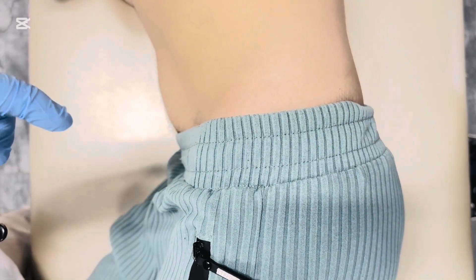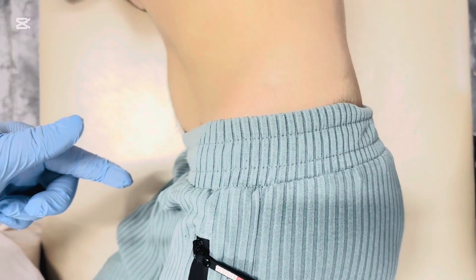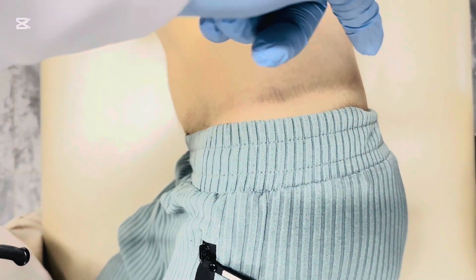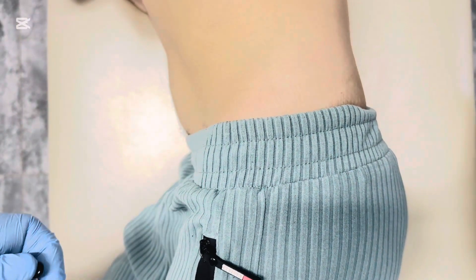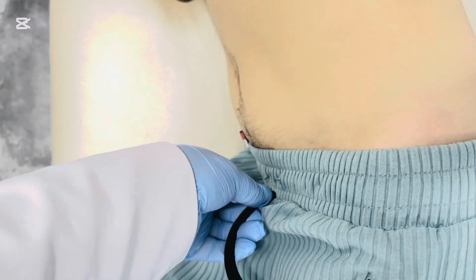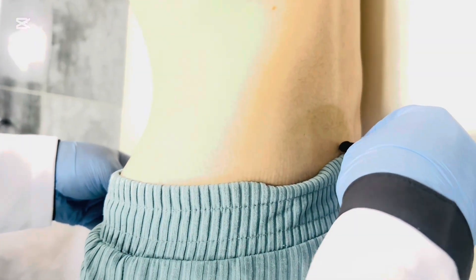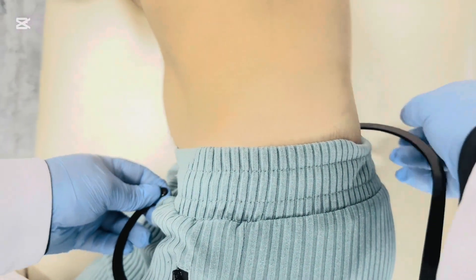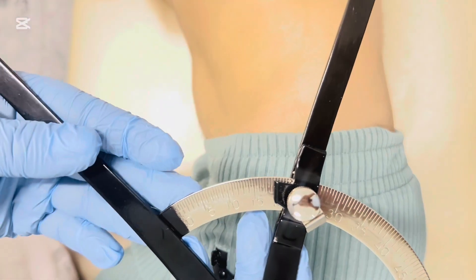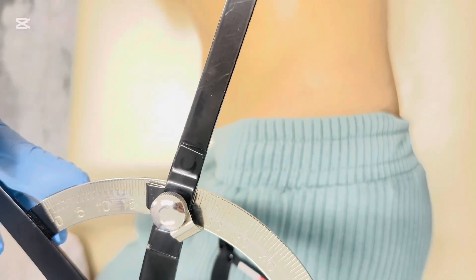We also have the conjugata externa. It is the distance between the midpoint of the superior surface of the pubic symphysis and the supra-sacral fossa. The normal distance is from 20 to 21 centimeters. We measure like this — this is the superior surface of the pubic symphysis and this is the supra-sacral fossa. Here it reads 19, but the normal is 20 to 21 centimeters.